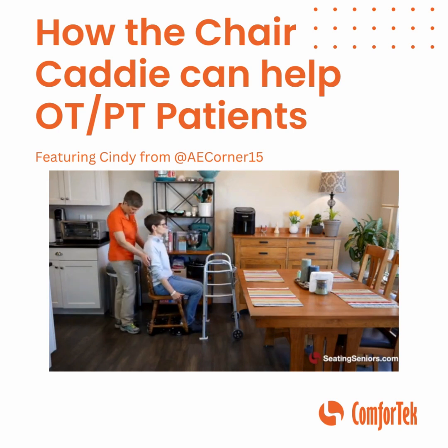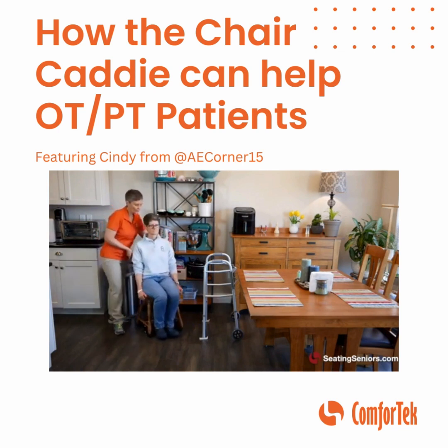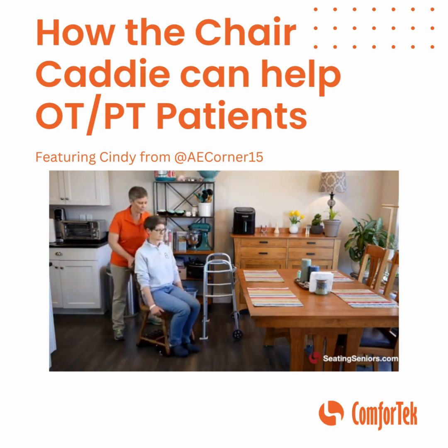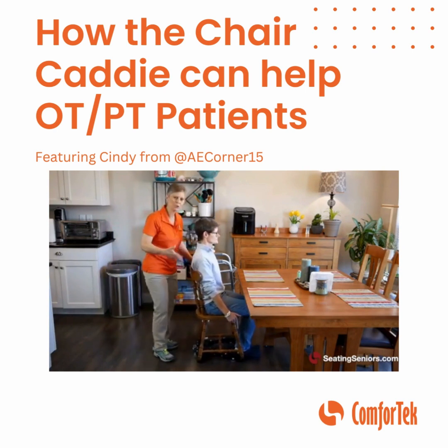Once she's seated, I'm going to release the brake here, and I'm going to wheel her right up to the table. Now with this, as you can see, this reduces the pushing and the pulling and the twisting on the caregiver trying to get the chair up to the table, as well as stress for the individual.